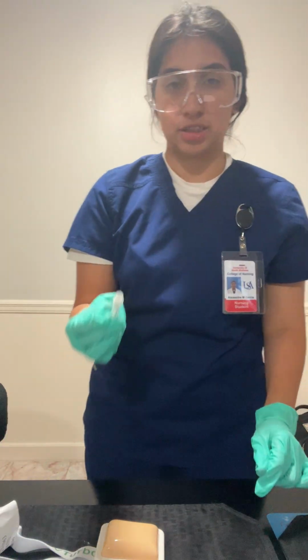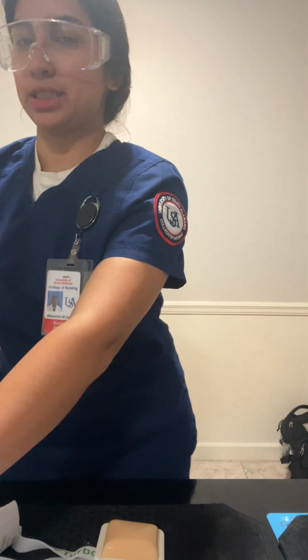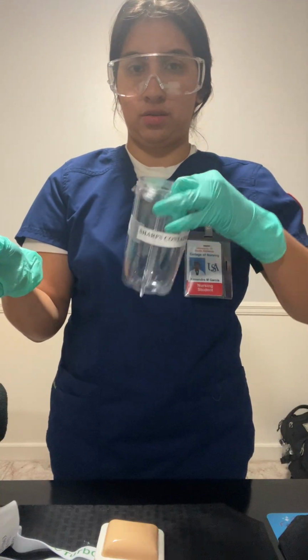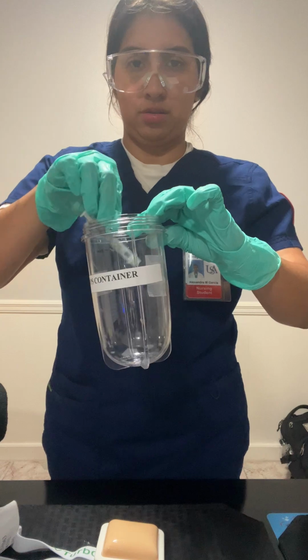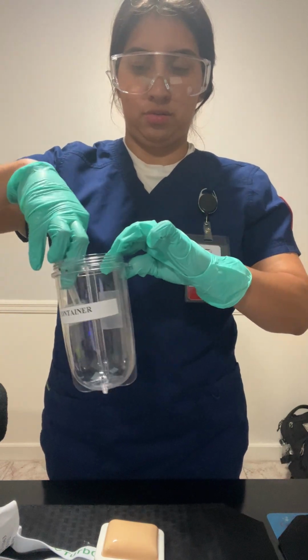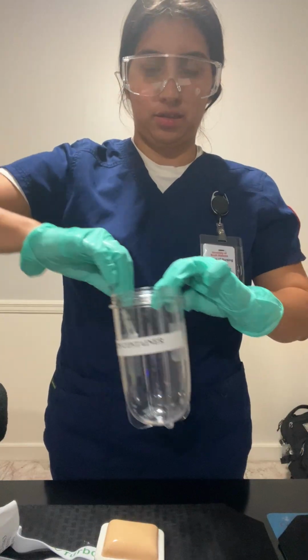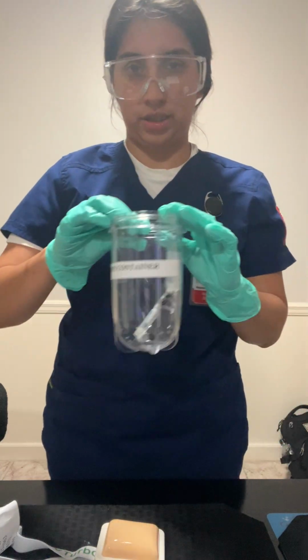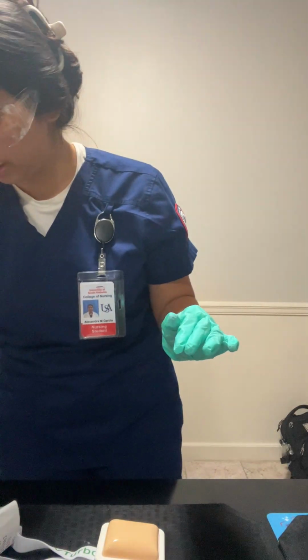And now I'm going to dispose of this syringe in my sharps container, which is here. I think I got stuck with that. There. Now I'm going to press on the skin.